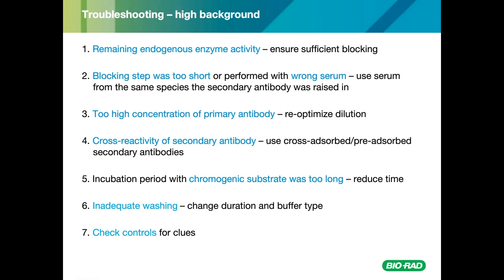Does the tissue itself autofluoresce? Does the secondary antibody only control show a signal? Then it's most likely that the secondary antibody cross-reacts with endogenous immunoglobulins. If your negative control shows background, the reason could be that the blocking serum was contaminated.